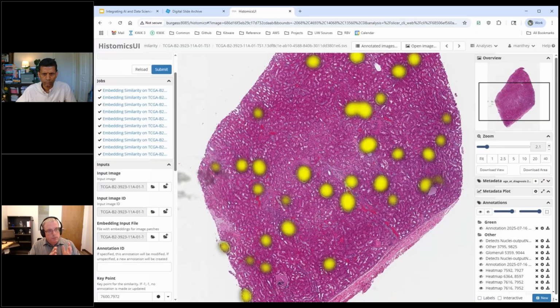There's some tie-ins where we say, I'd like to contribute back an annotation here. So the output from this is an annotation JSON file, and I could say from the command line, just give me a JSON file. Or I can say, oh, upload it to this interface so I see it right away. So it depends on how fully integrated it is. There are some things like the guided labeling, which we were showing earlier, where some of the models are very integrated and would be complex to run outside of the UI, but could be done. And others are not as complex. So the blob detection is something you definitely can run. It's even a Python package you can run separately.